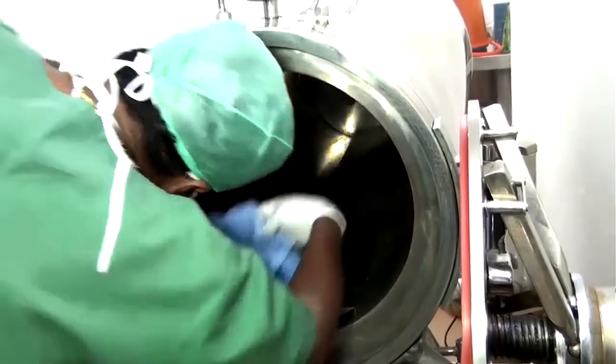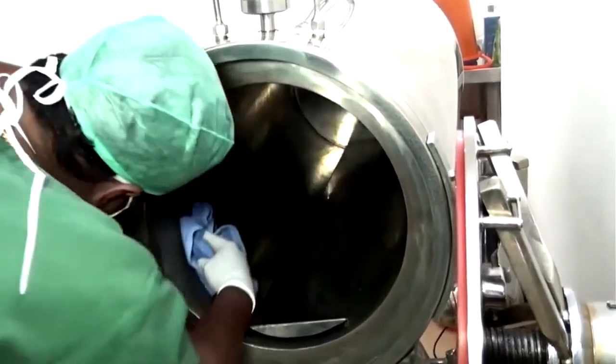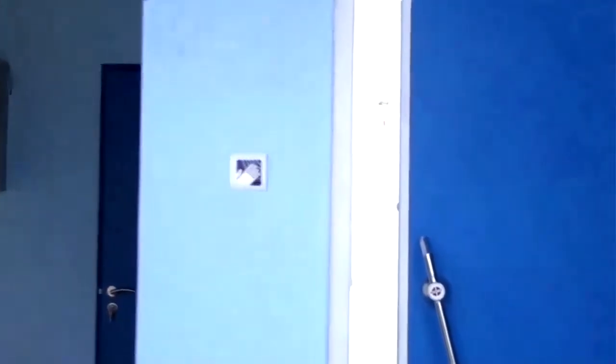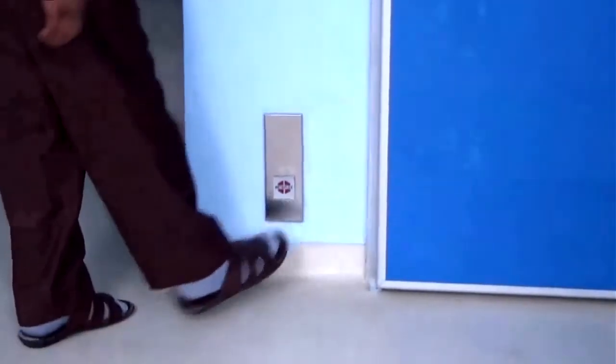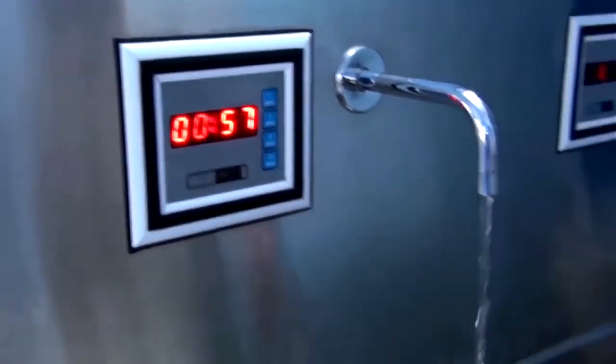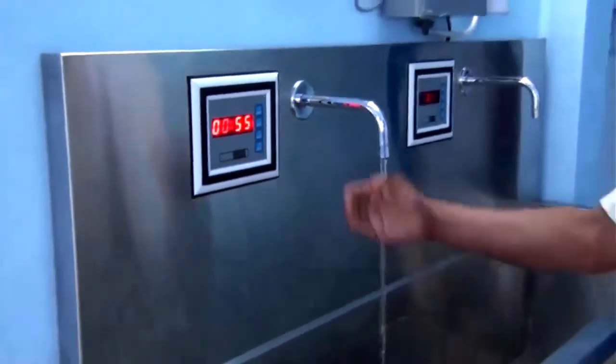This autoclave is one which we normally neglect. This also needs to be cleaned, and see, even there he is following the unilateral direction. This is the modular theater where your touch is almost nil everywhere. This is the HEPA filter. The surfaces are coated, and even the scrub area is all sensors.